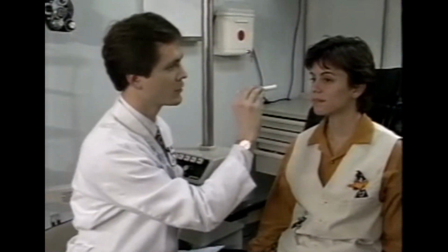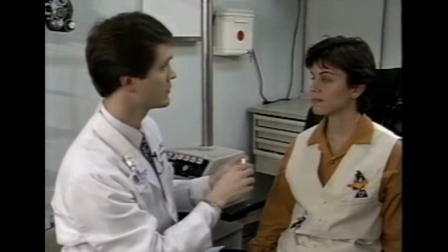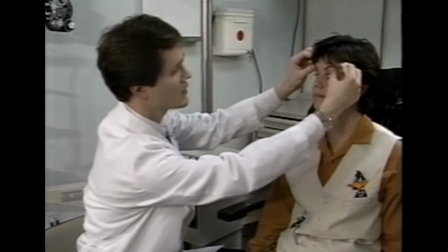Use your penlight to illuminate each of these structures. Then have the patient look right, left, up, and then down, while you inspect the conjunctiva and the sclera. Next, you will perform direct ophthalmoscopy to assess your patient's ocular media and retina.